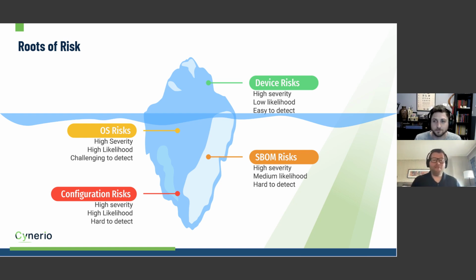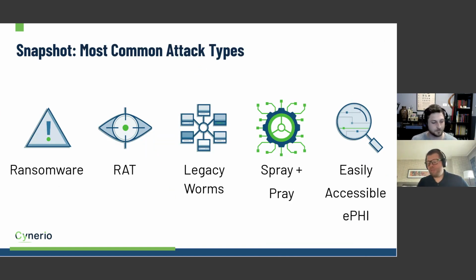Yeah, IV pumps are the perfect example, and we have all kinds of studies around that we can pass along. So good question. So Asher, what I'm going to have you talk about in a little bit is the actual types of attacks we're seeing. And we're going to go from ransomware, which is by far the one we're all terrified of, where someone will come in, encrypt your system and say, give us X number of dollars and we'll restore it.